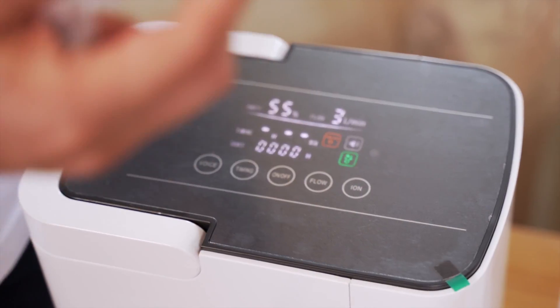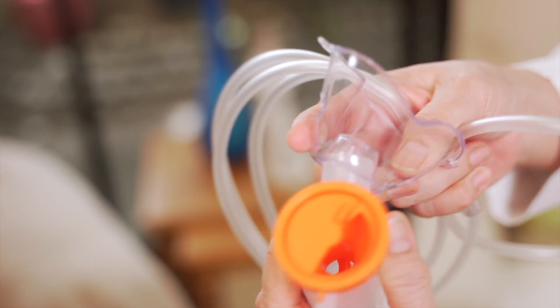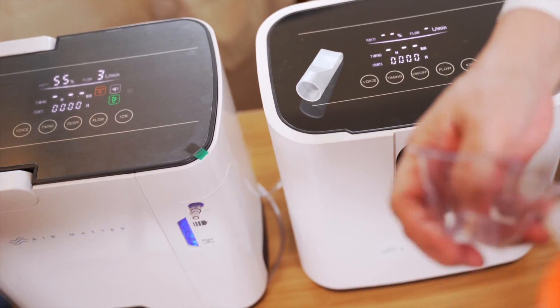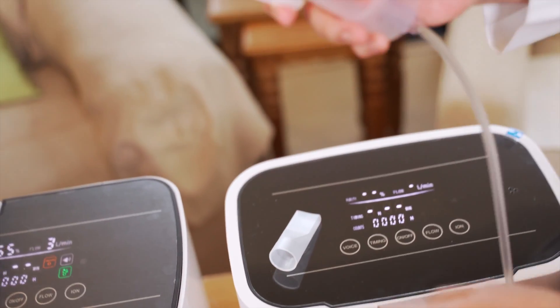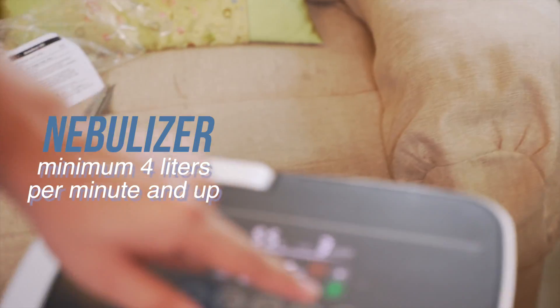Here is the nebulizer kit. You open it and attach the tubing here. This is where you put the medication — for example, salbutamol for asthma, or whatever the patient needs. You put the medication here and attach this. You'll notice that air comes out here. For nebulizer use, we recommend a minimum of 4 liters per minute and up.